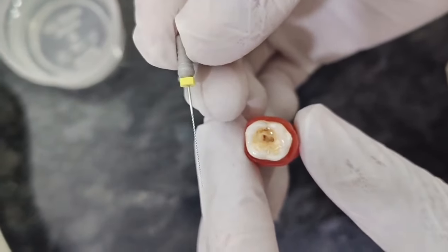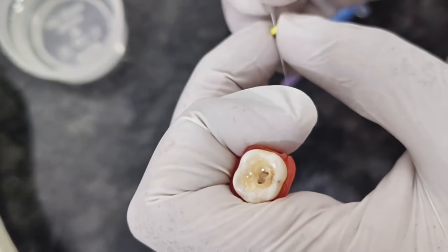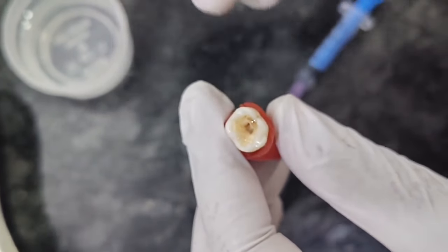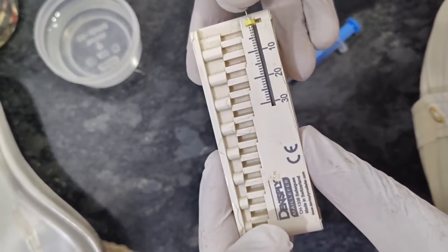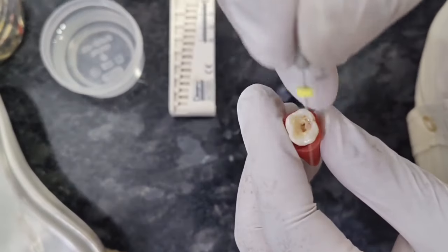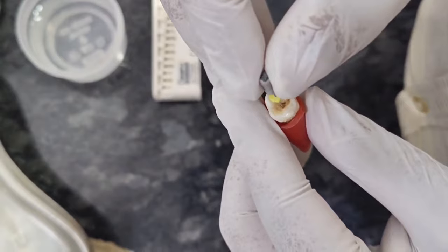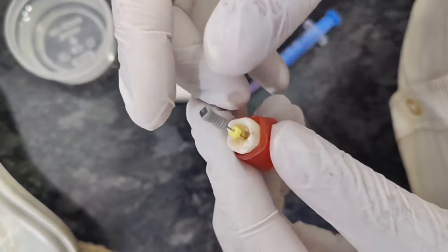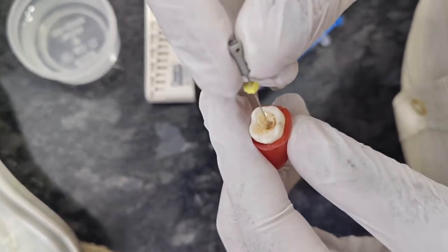So this is the number 8 K file, and I have already checked the working length of the tooth. It's around 18 mm. Now we are inserting it in the distal canal. So you see the angulation. In a watch winding motion, you have to file just a little bit.